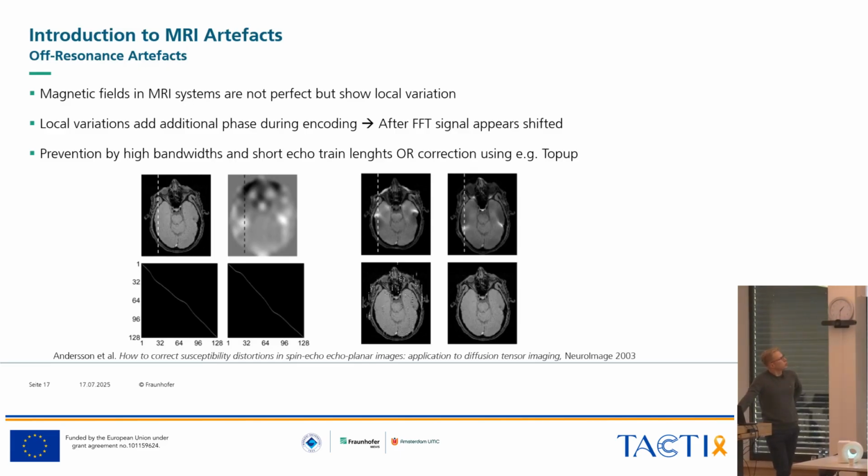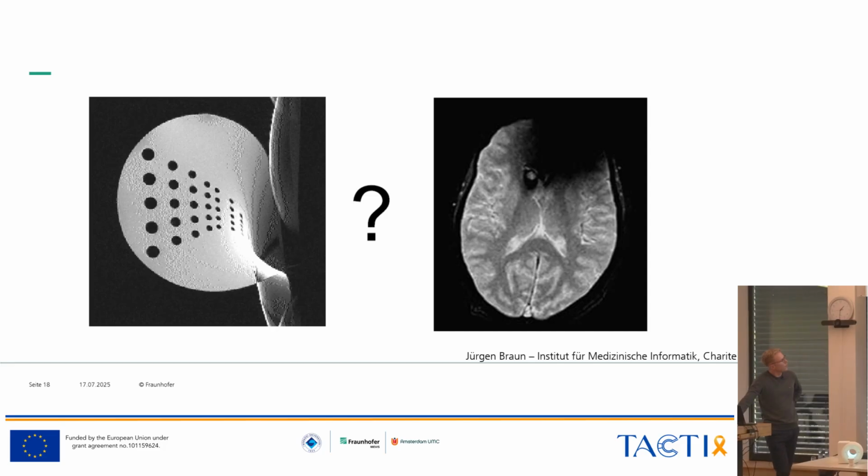So a special artifact which is somewhat related to that is this. Anyone knows what's going on there or has an idea? Yeah? Maybe it has to do with the air tissue interface, but I'm not sure. Yeah. I see that it's close to the sinus.